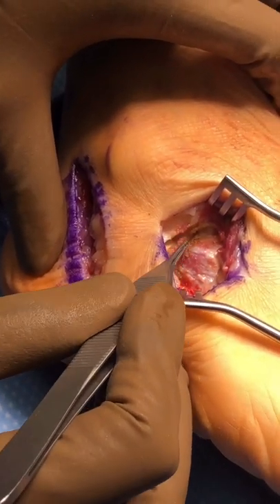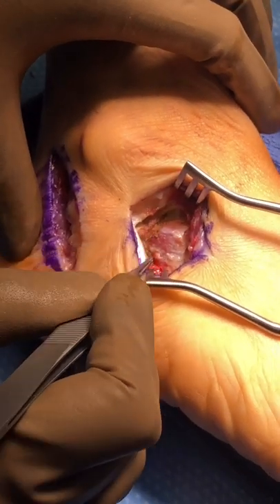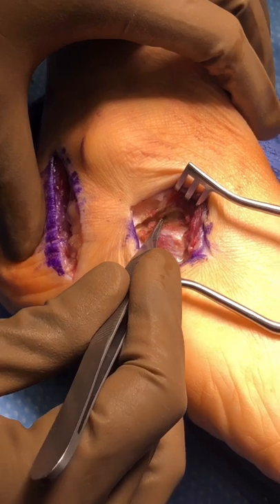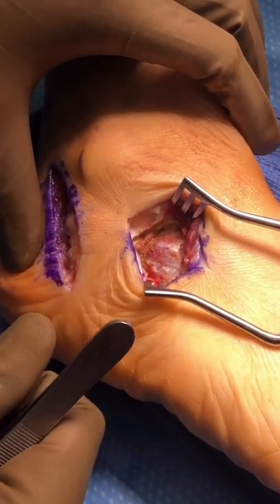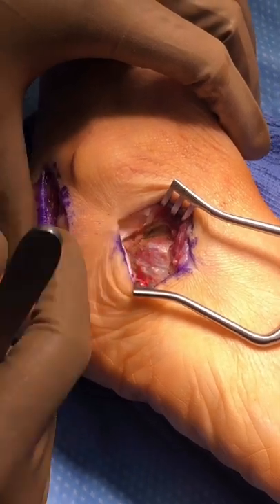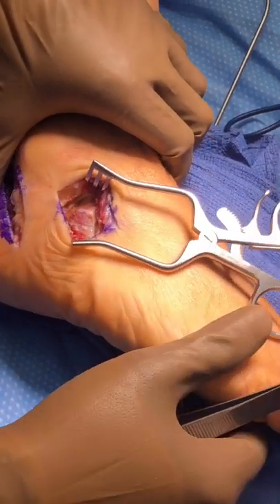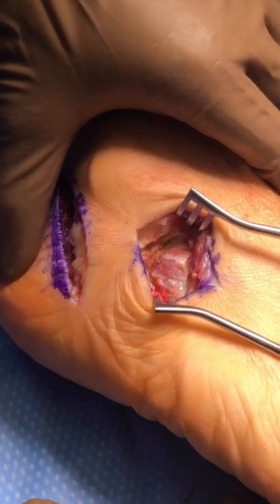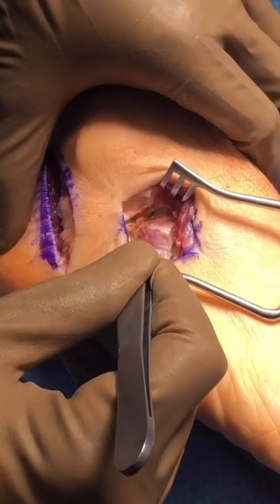We've made a second incision on the side of the foot at the anterior process of the calcaneus. We'll make another cut along this line and put a block of bone there to lengthen the outside of the foot, swinging it back into alignment. We'll use a pre-made cadaver block of bone specific to this particular osteotomy.